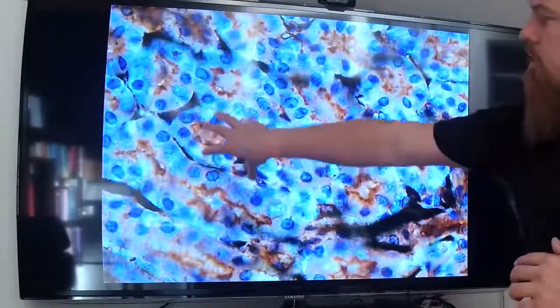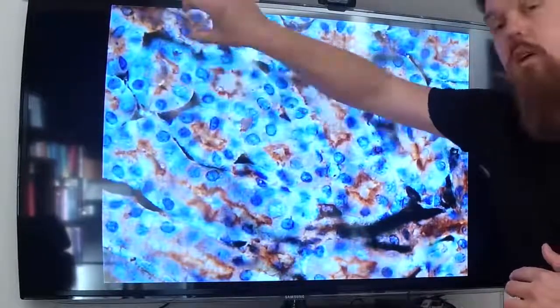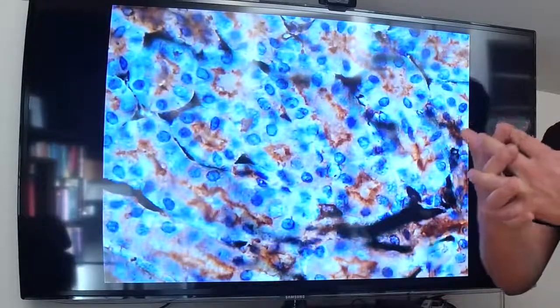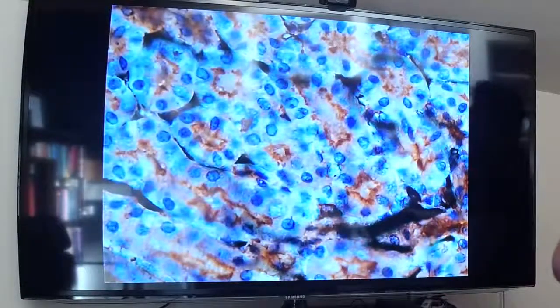And so here what we've done is we've taken that kidney and then added a stain for cell bodies and then immunostain for smooth muscle. So the black are the original blood vessels. And now you can see, you know, the kidney tubules coming this way, and this one's cut perpendicular, interleaving with the blood vessels.